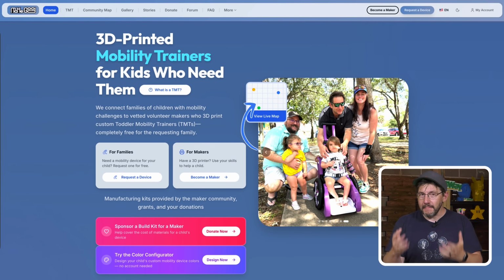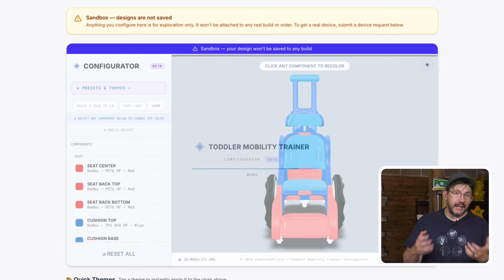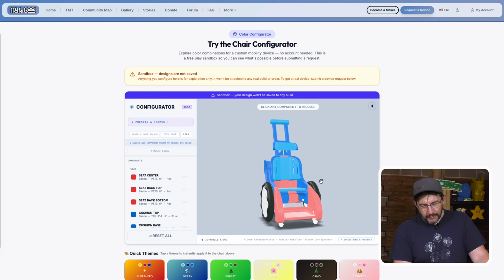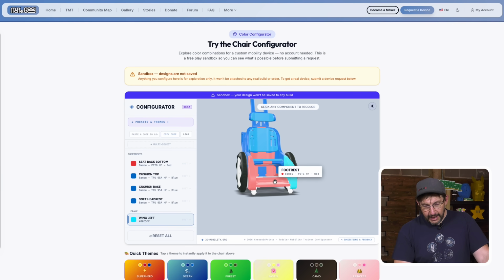If you go to 3d-mobility.org, you can sign up to be a maker, which is great because then you can make these for someone who's in need. But if you go towards the bottom, try the color configurator. It loads up, it says it's beta. You are presented with a TMT right there, and you can move it around, take a look at it. Now, if you click a part, then you can click a color. You hit apply, and that part becomes that color.